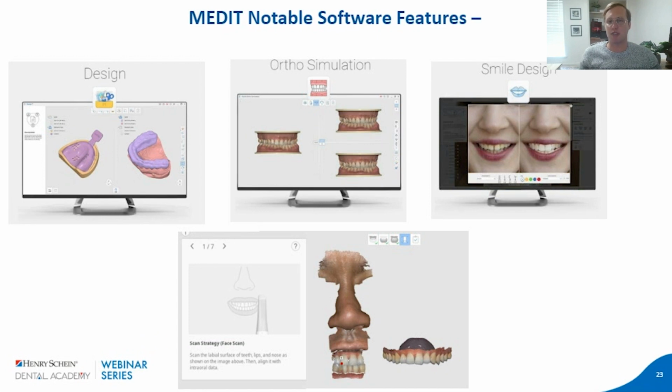But if you want to use any of their notable software features, for example, like MEDIT Design, which is great for comparing scans when patients come in over time. So you can see any gingival recession, any grinding of the teeth. You can overlay a patient's scan one over the other to see any progression within their intraoral cavity.